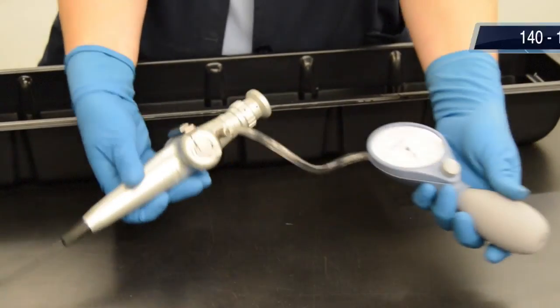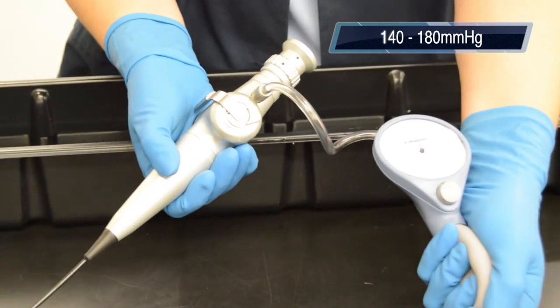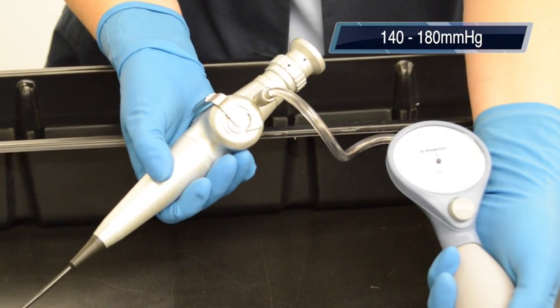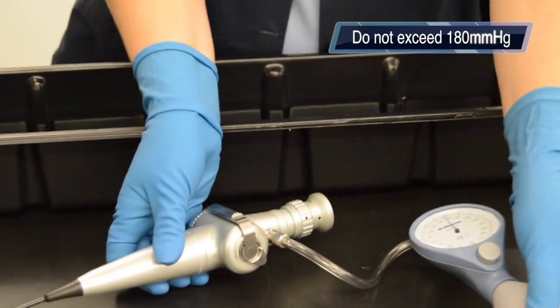Pump the hand bulb of the leak tester until the needle is within 140 to 180 mmHg or the green gauge area. Do not exceed 180 mmHg.